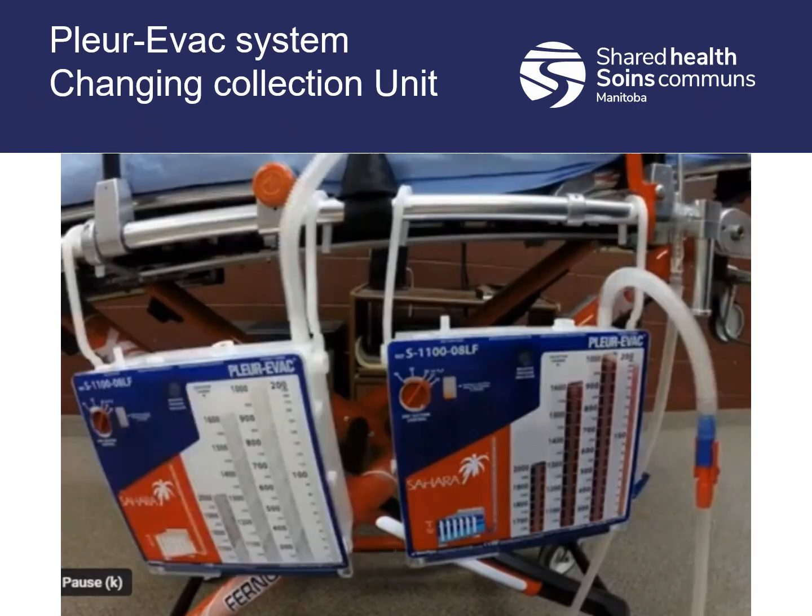If it's still draining, but the collection chamber is starting to get kind of full, don't wait till it's full all the way up to deal with it and switch over to a new device. When you start getting into that last collection chamber, the shorter one, that's when you should be prepping your new collection device. I'd strongly recommend that you get it prepped. So get your new one out of the package and get it all set up. This is not a sterile procedure to switch the collection units, but we want to keep it as clean as possible, because like anything in medicine, we don't want to risk introducing infection into our patient at any point.